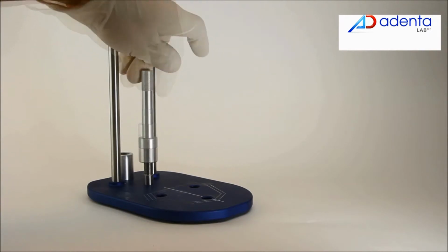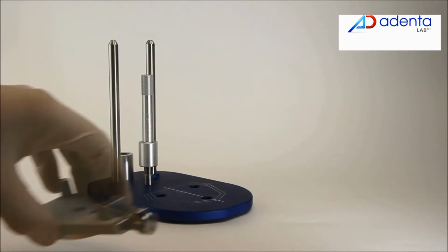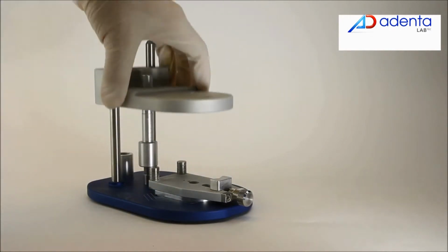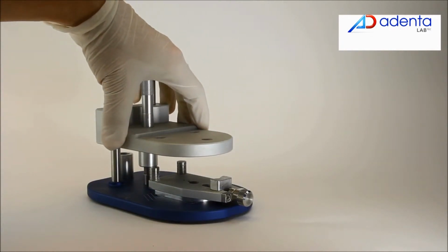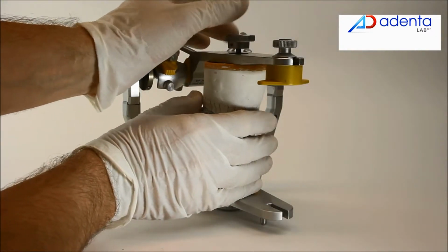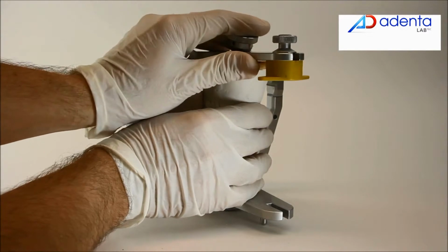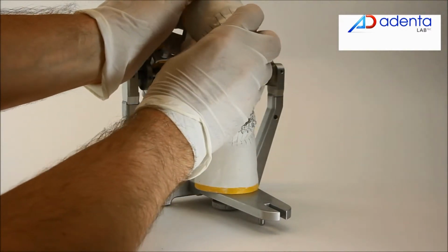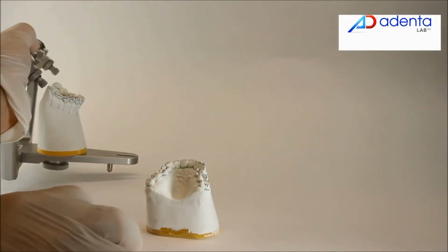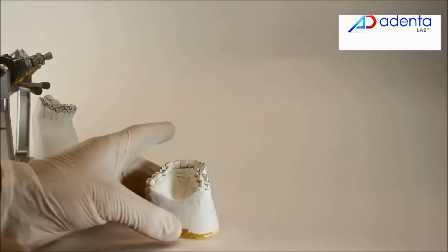Take the Setup Model Maker and place the EasyClick model fixation and Setup transfer plate on it. Transfer the model to the EasyClick model fixation.